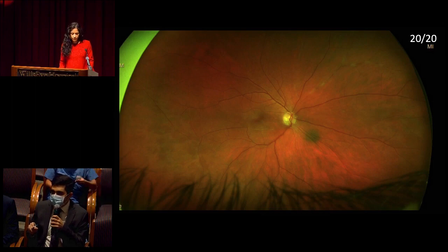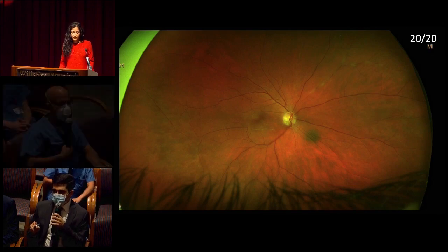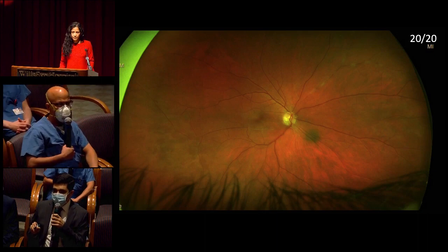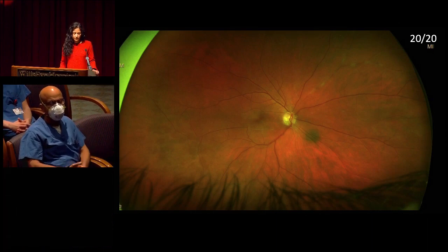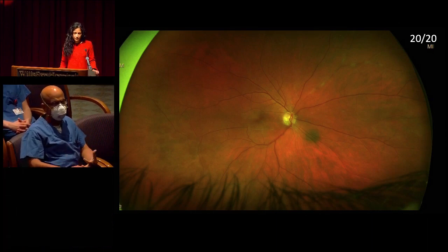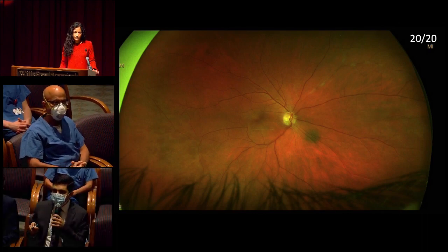Those vessels appear to be predominantly arteries. Inferotemporally, where the mottling was described, the vasculature appears attenuated — I don't appreciate much in terms of vascular structures, so it may be associated with some hypoperfusion as well.